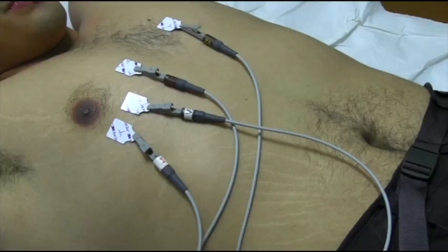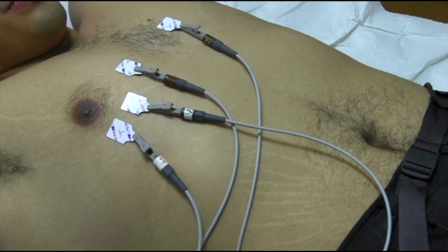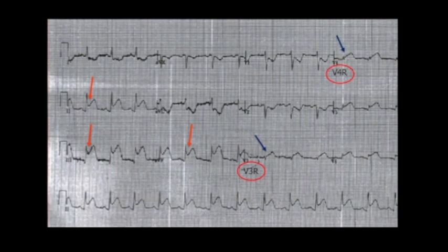The answer is we must do right-sided leads. To obtain right-sided leads, we take leads V3 and V4 from the left chest and move them over to the right chest. The limb leads stay in the same place. We now run the EKG again. Now, V3 and V4 are reading the right ventricle. They are now called V3R and V4R. We now look for ST elevations in V3R and V4R. If they are present, that signifies a right ventricular MI.